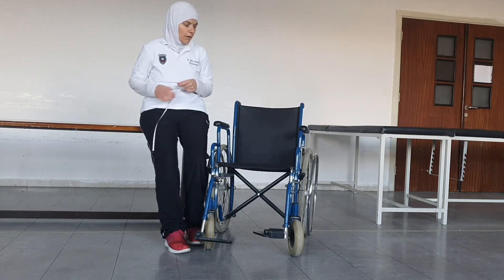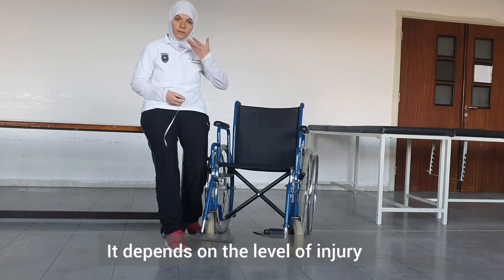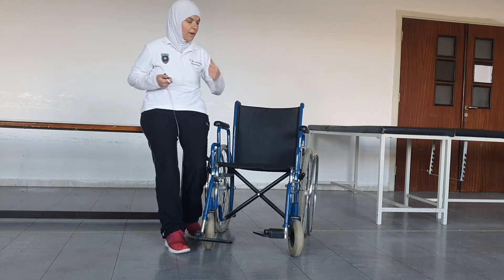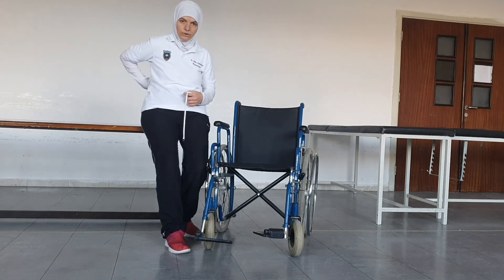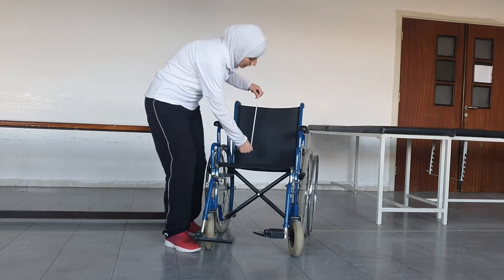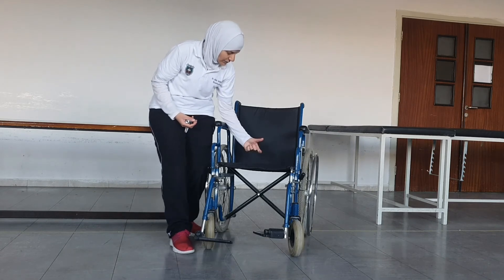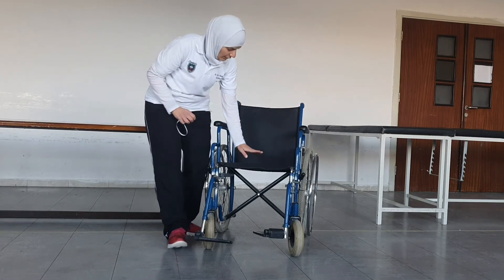The second measurement is the back height, which depends on the level of injury. Higher injuries require a higher back. For lower injuries, if the patient is going to propel their wheelchair, we need to clear the inferior angle of the scapula so the arm can move freely. We measure from the inferior angle of the scapula to the sitting surface and correlate this with the chair's back height. Importantly, the cushion must be placed on the chair when taking this measurement, as the cushion thickness affects the patient's actual sitting height.